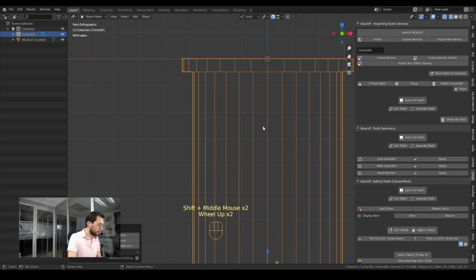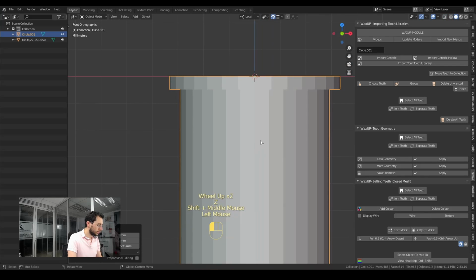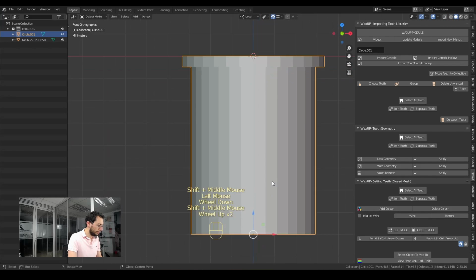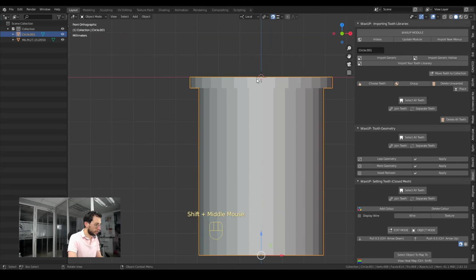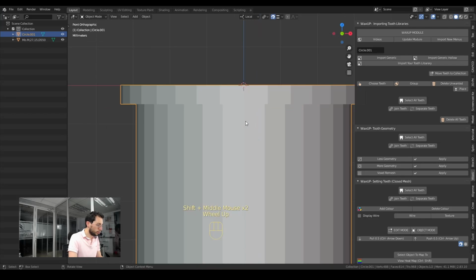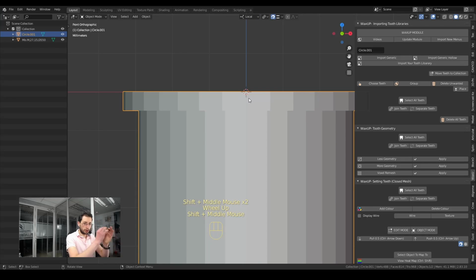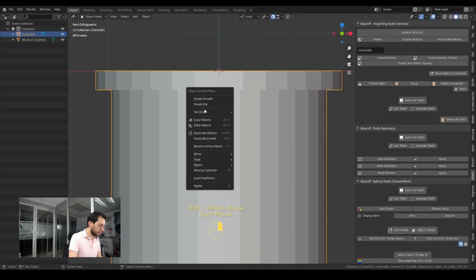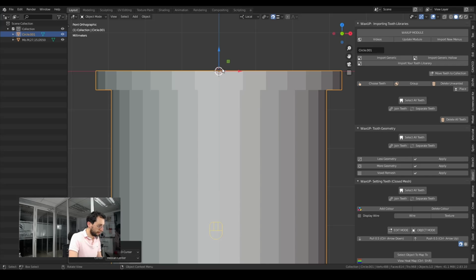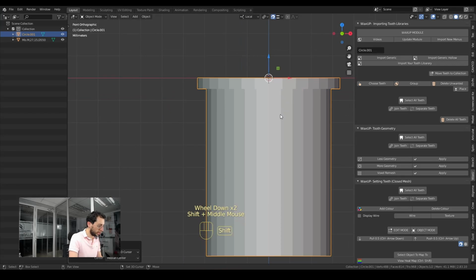And finally, because when I do this, I go back here, I get an origin in a different place. Look at this, the origin is down here and I need it here. I have to move the origin exactly to the middle of the world. And that can be done by right clicking and choosing Set Origin to 3D Cursor. And now my origin is right there.